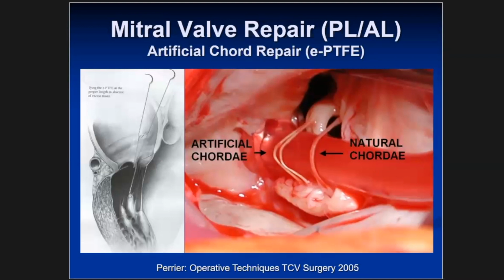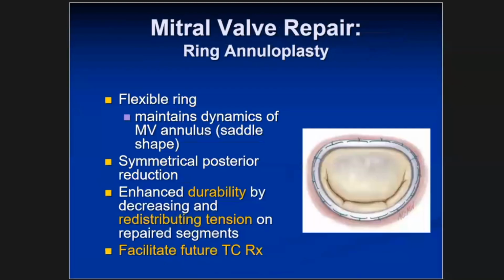So this image, again, reinforces the fact that when you look at cords, and this is an image showing a natural cord, an artificial cord. If you look at them many years later, you can't tell the difference between the artificial and native cord.